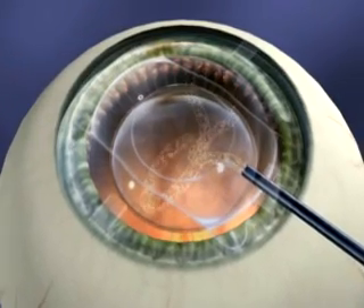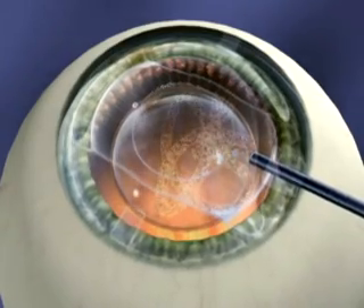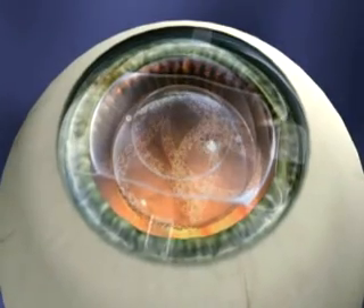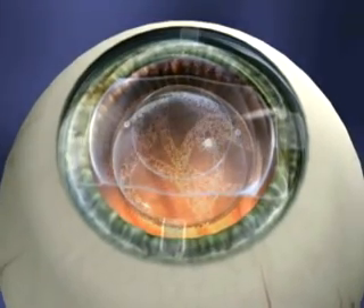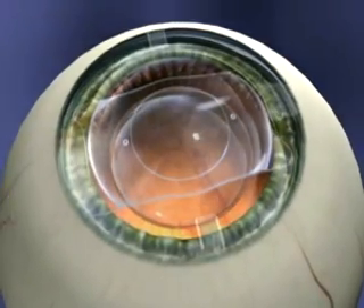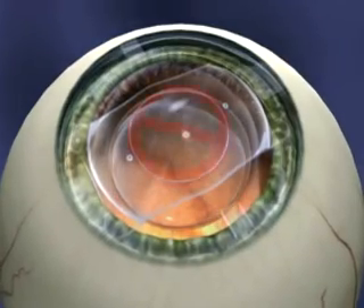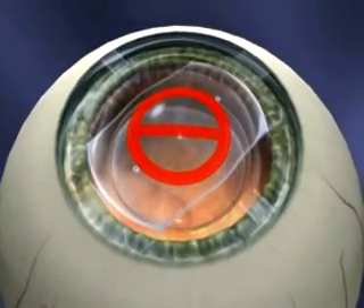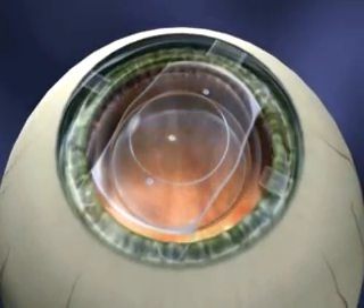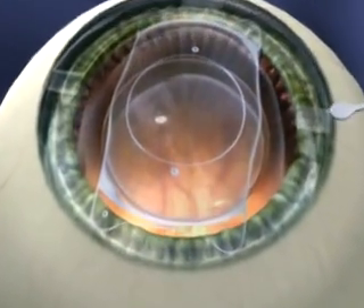Once the ICL has unfolded, inject additional viscoelastic on top of the lens to give yourself more room. Never inject viscoelastic underneath the lens. Now the ICL must be repositioned posterior to the iris plane via the paracentesis using the ICL manipulation instrument. Keep in mind that the central 6 mm of the ICL is considered the no-touch zone. Avoid going across the visual axis. Manipulate on the peripheral area, never on the optic.